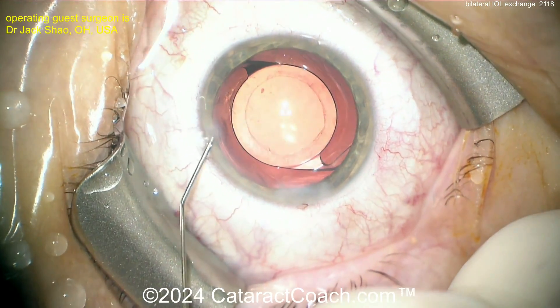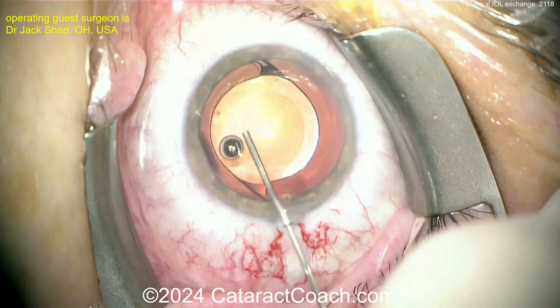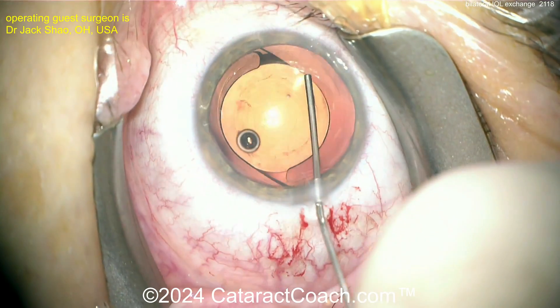End of the case — nicely done. Be careful though: a patient demanding a bilateral IOL exchange may also be the same patient who will complain if you're even slightly off target. If you aim for emmetropia and the patient ends up at minus a half diopter, don't be surprised if they're upset.